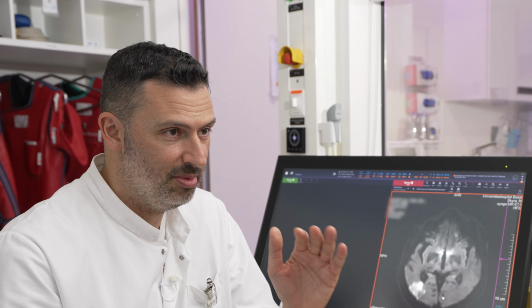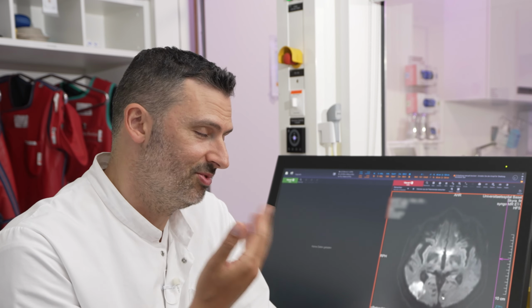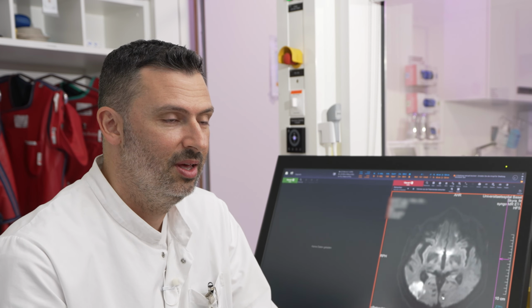I think for everybody, every neuroradiologist, neurologist, neurosurgeon, it's important that perfusion has a place in distal thrombectomy, in distal diagnostics. If you want to find those occlusions, you need to use your perfusion imaging as a MeVO detector, as a DVO detector. So that would be my first point, and this is just a great case showing that.